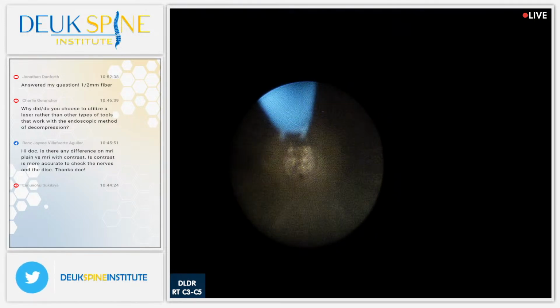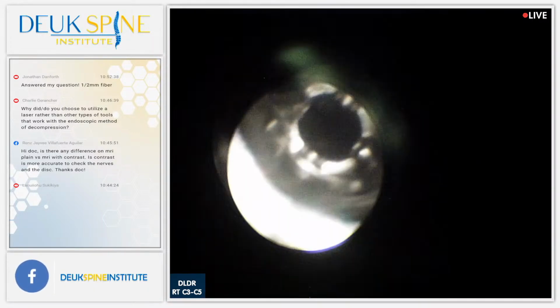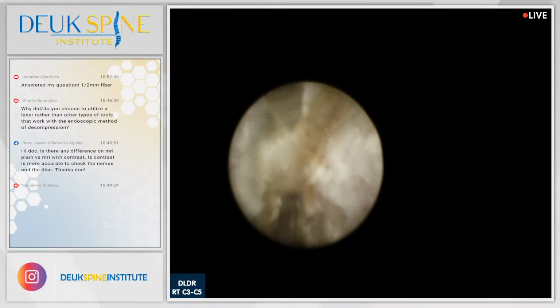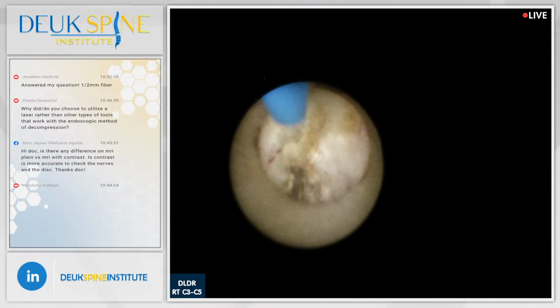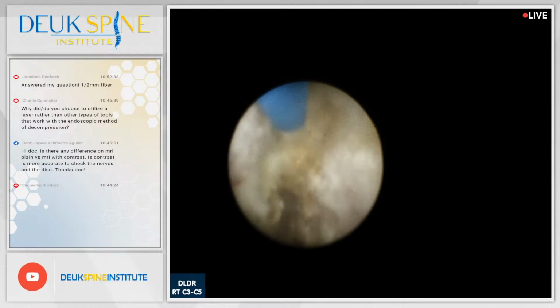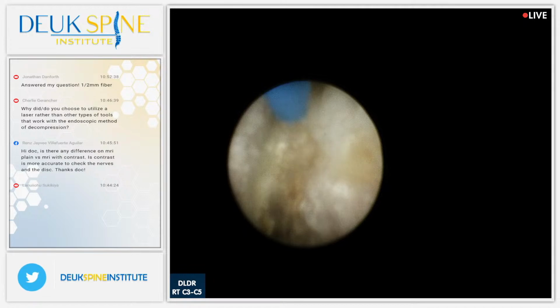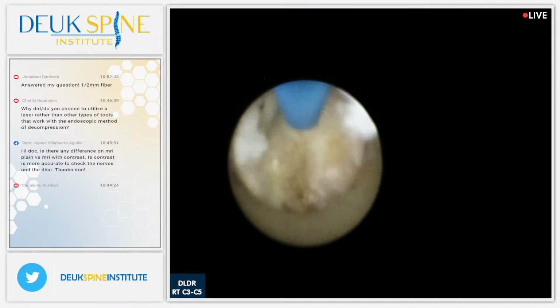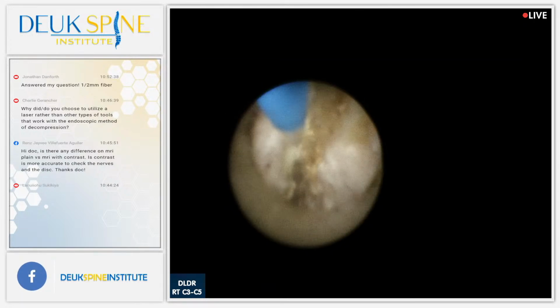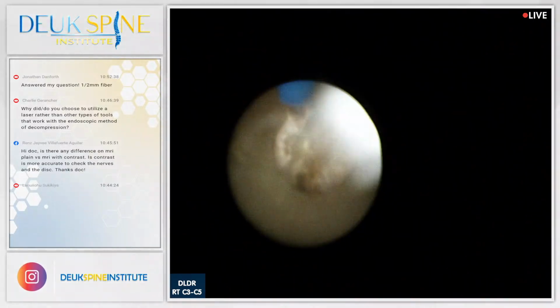All right, almost done. We ran into a big piece of herniation. We're breaking it up into little pieces with the laser, not possible with any other tool. And just about done here. Again, this is 4-5. We've got to do 3-4 next. This is all scarred, calcified herniation. And you can see the posterior ligament fibers there, bone spurs. We're taking them all down with the laser.